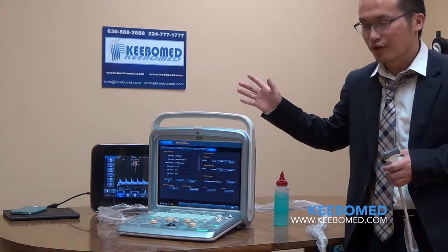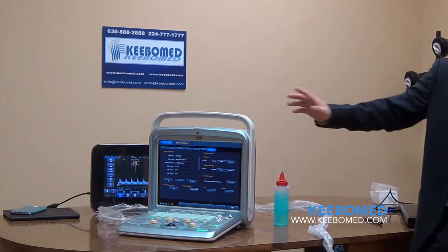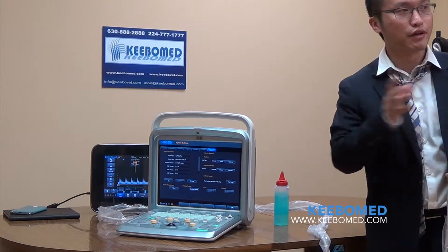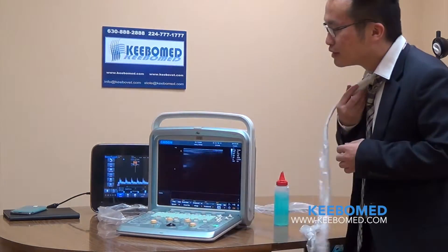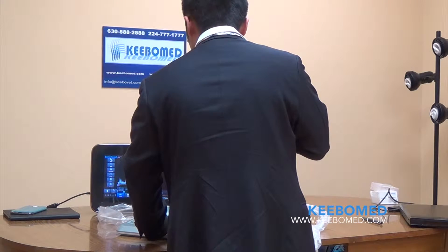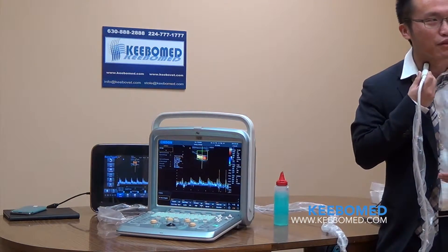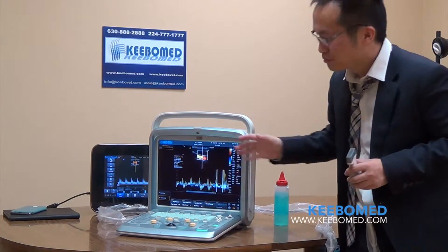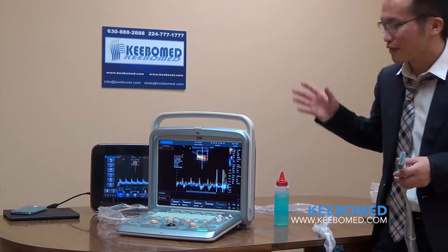Today I am introducing the new model, the Q9. Compared with Q5, the Q9 has some new capabilities. First, this model can support continuous wave, which means we can support CW Doppler probes, allowing you to sell this machine in cardiology applications. Second, we have new features like BBC mode — B mode and color mode simultaneously in real time. Unlike some other ultrasound systems where you need to freeze first, on the Q9 you can do measurements even in real time.